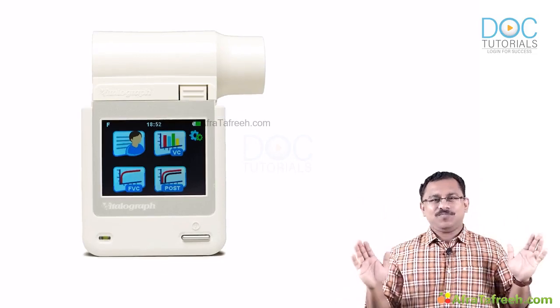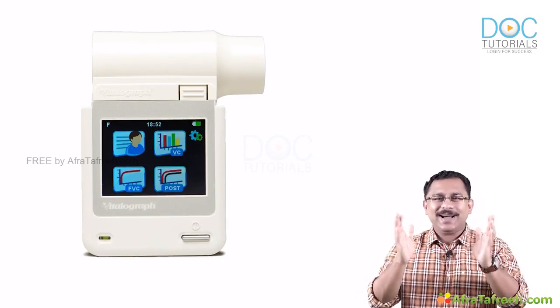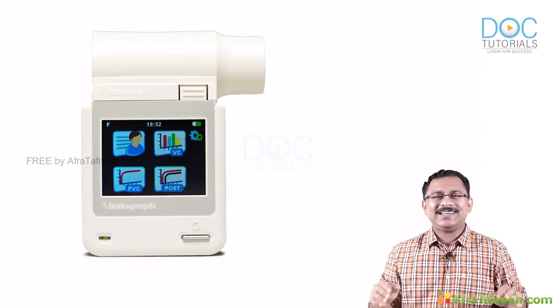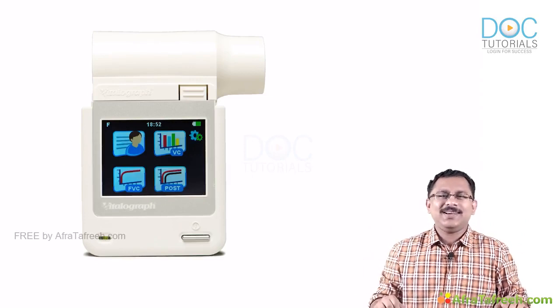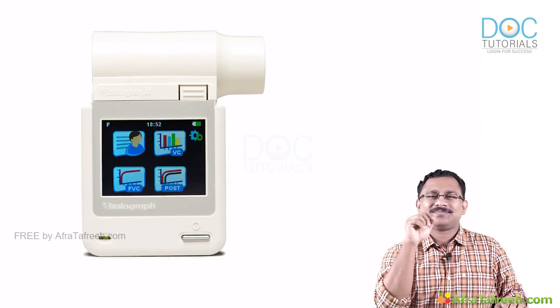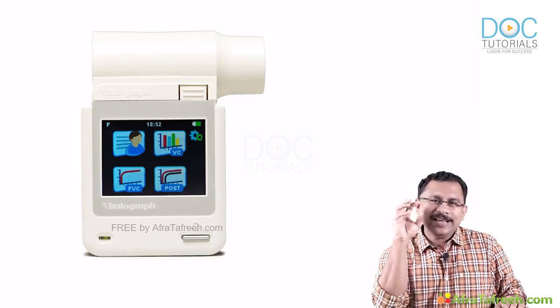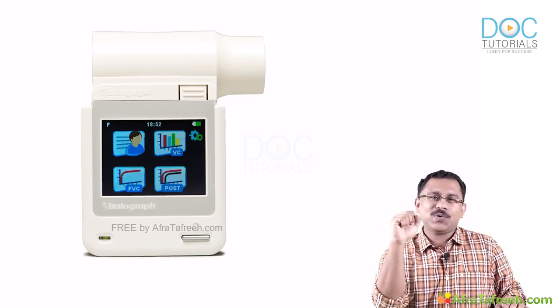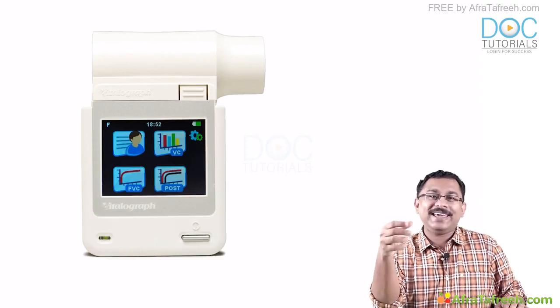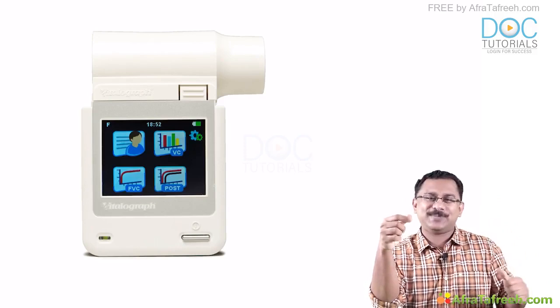So suppose we are having a spirometer lab. Now I'll ask your imagination to go to a spirometer lab where you have a patient, maybe even a normal individual, who is forcefully expiring into the handheld device. When he is forcefully expiring, you tell me what is the maximum amount of air that he can forcefully expire after a maximal inspiration?